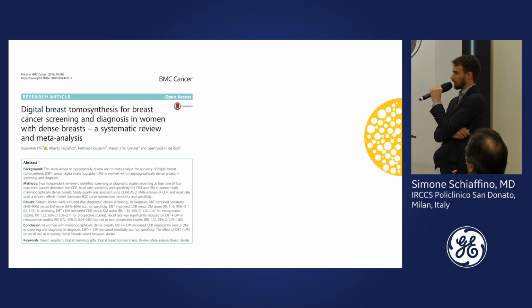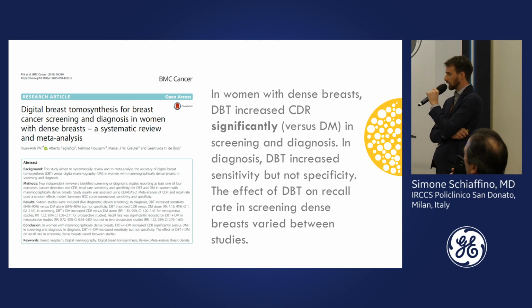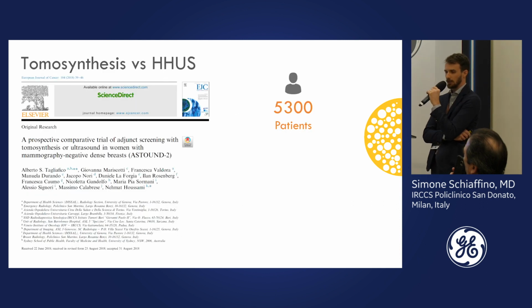About handheld ultrasound, my friends from Genoa published this important study, the ASTOUND 2, that is the last part of a study with the interim analysis published 2 years before this one. This is a multi-center study of asymptomatic women with negative mammograms.